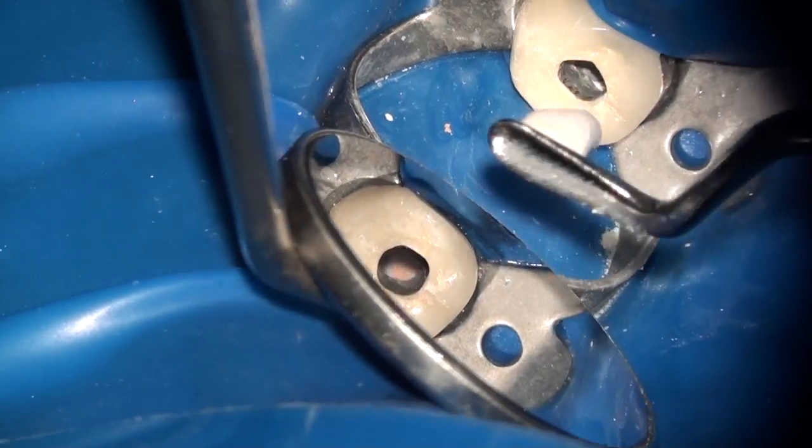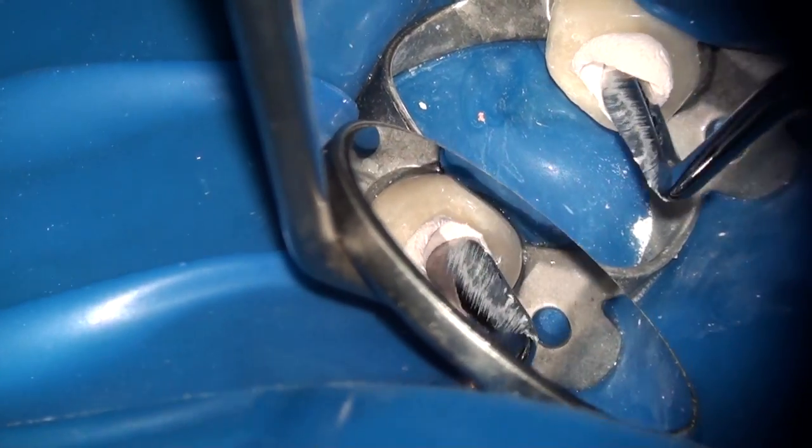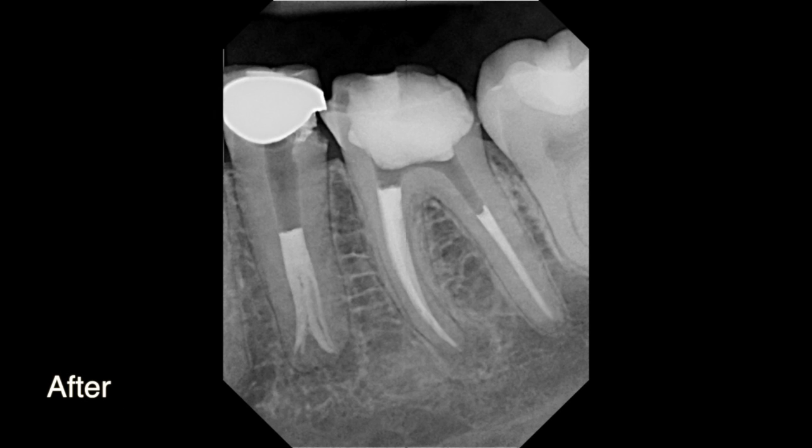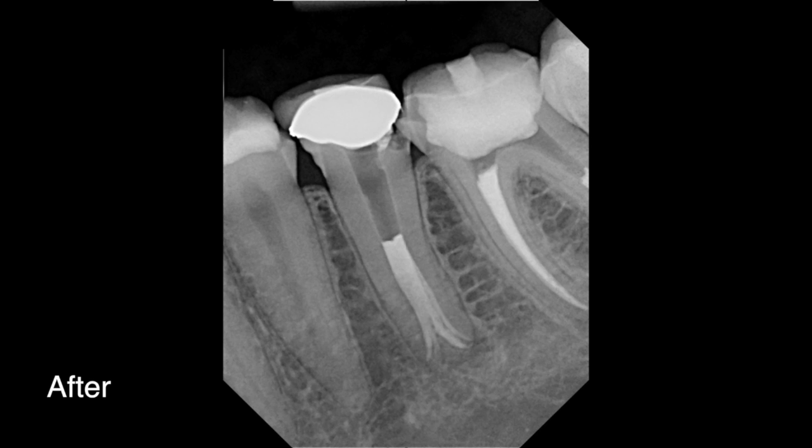Once the condensation is completed, a Cavit is placed in the access opening. Here you can see the case before instrumentation, and here it is immediately post-op. You can see that we actually ended up having four canals filled with the gutta percha and the BC Sealer, and the BC Sealer has very nicely flowed into these areas.